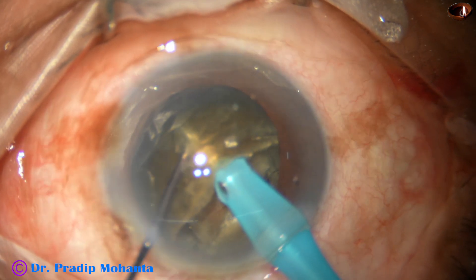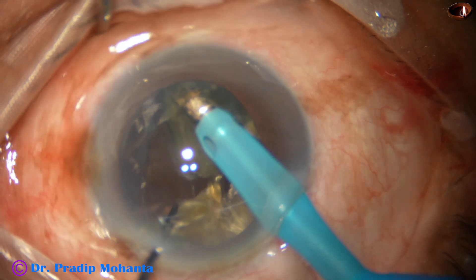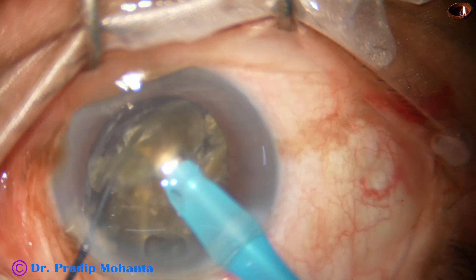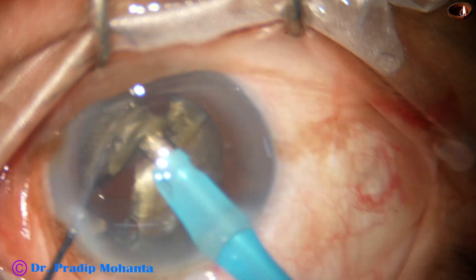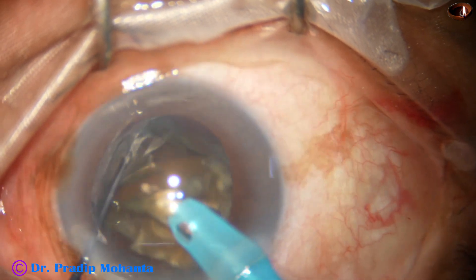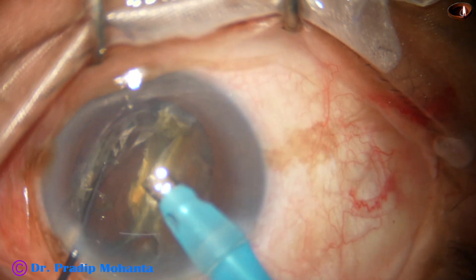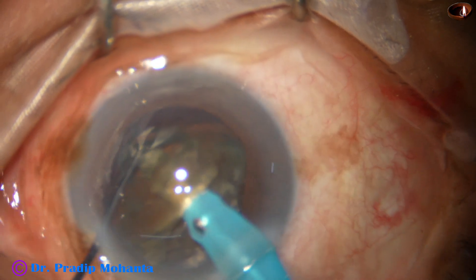Hold the heminucleus and separate the two heminuclei completely. Each heminucleus is then subdivided into two large pieces, or sometimes three large fragments. The large nuclear fragments are tilted. The FACO needle is placed just beneath the apex of the nuclear fragments and they are emulsified. See what I am doing — I am detaching the epinucleus shell and emulsifying the nucleus.